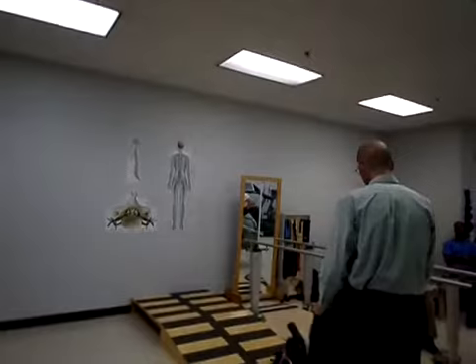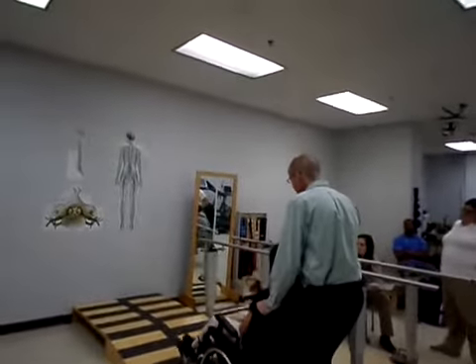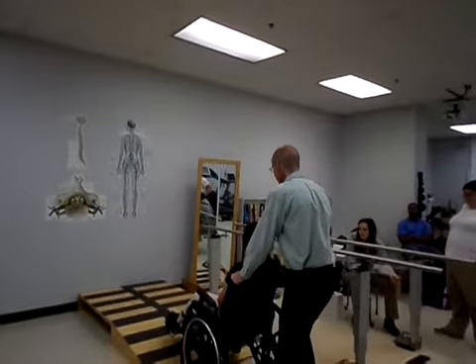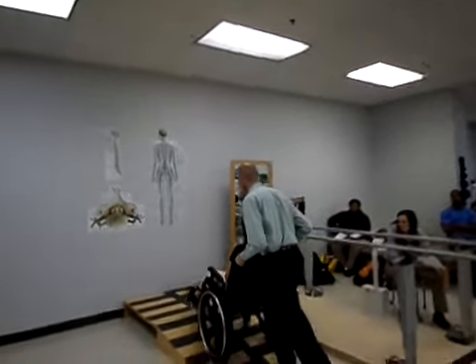Okay, and you have to do kind of a little wheelie first. I'm going to tip you back, okay? Get the caster wheels on there, nice and gently. And then get in close and push her.